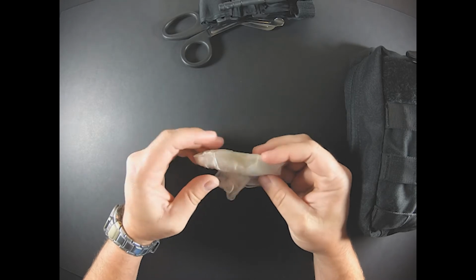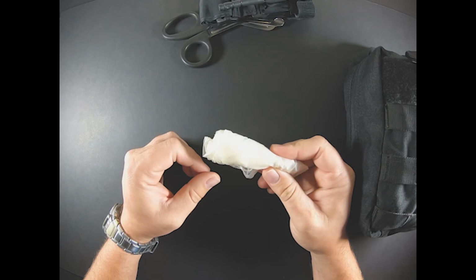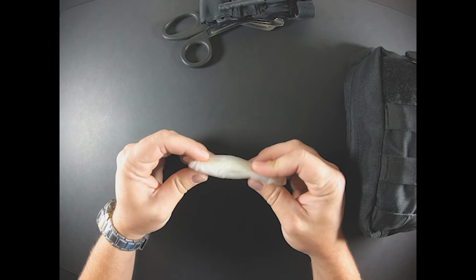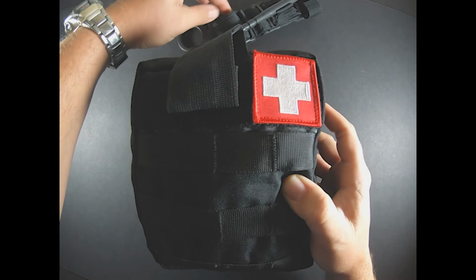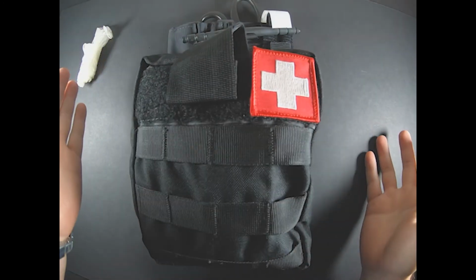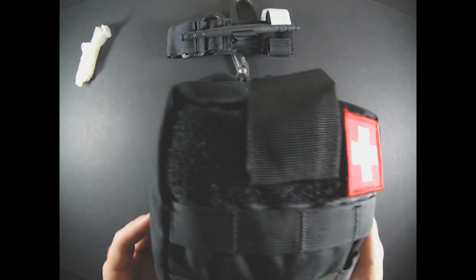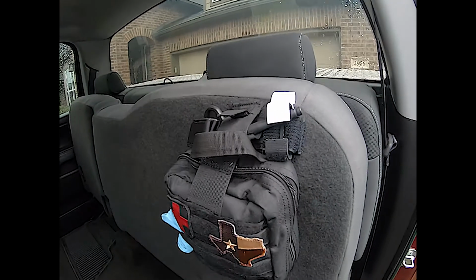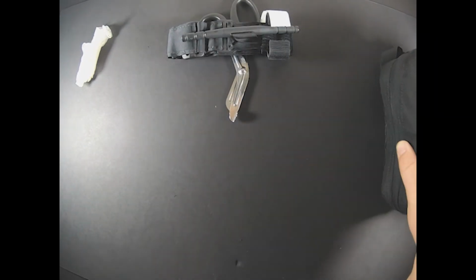These are non-latex gloves to protect either the person using them or to protect the person that they are being used on. Some people are allergic to latex, so I've got these here. If you saw the way that the bag was sitting, the way it sits in my truck is very similar to what we have here. So if I move the bag off to the side, it's got this Velcro on the back. It Velcros to the bottom of the seat. I'll show that here just so we can kind of see what's going on as far as storage in the vehicle. So let's put that aside.